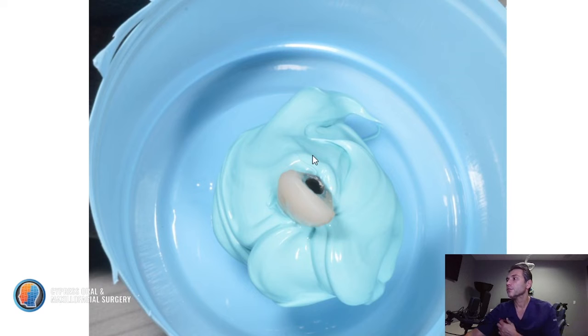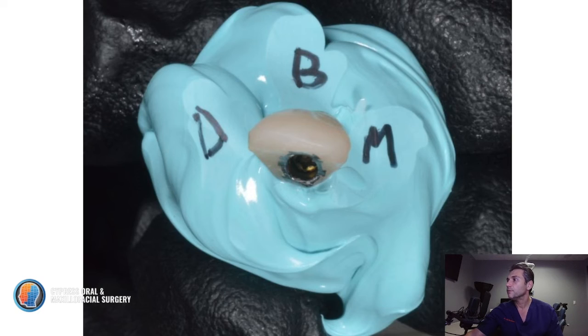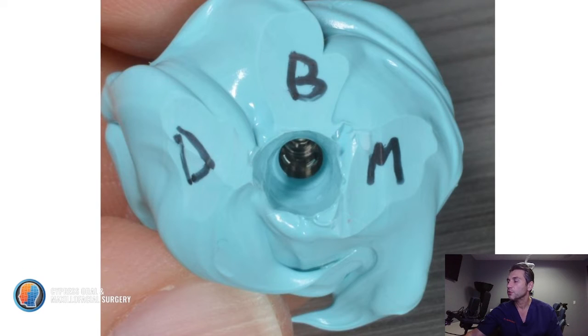The other thing here is you definitely want to mark where the buccal is, because sometimes you can get lost. So definitely mark buccal, mesial, distal. What you're seeing here, make sure you mark it.